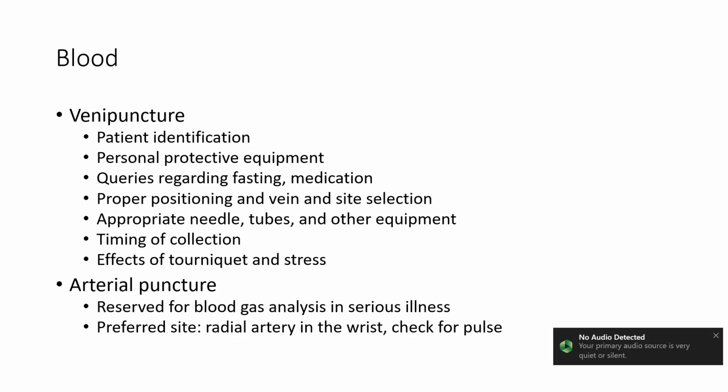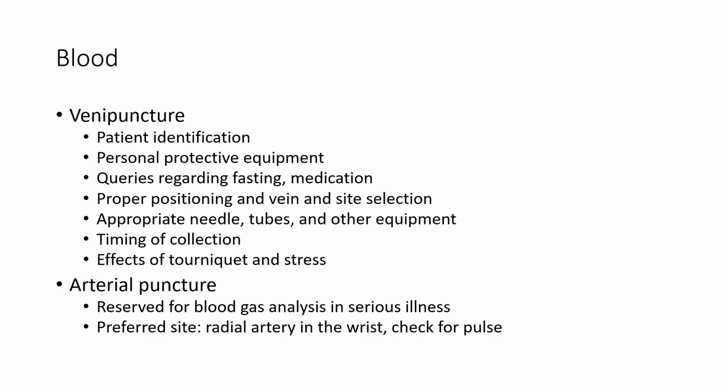When collecting blood, venipuncture and arterial puncture are two different routes. For venipuncture, you want to make sure that patient identification is verified, you're using personal protective equipment, and queries regarding fasting and medication are made. So you want to confirm with the patient, did you fast for so many hours? Or what medications are you taking at this time? Did you take any Tylenol, for example, this morning? Then proper positioning and vein and site selection. Depending on the patient, that's a call that is made of which vein would be more appropriate to collect blood.